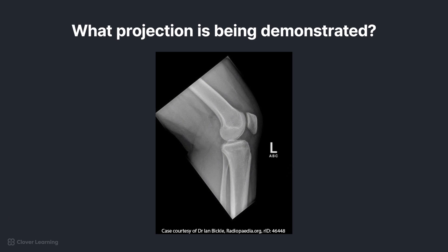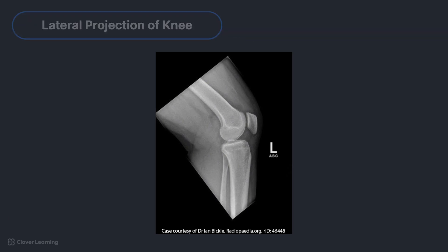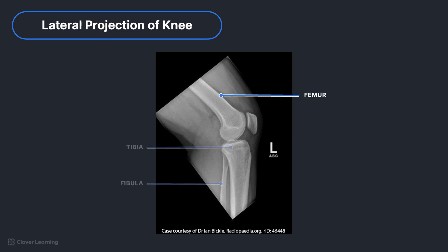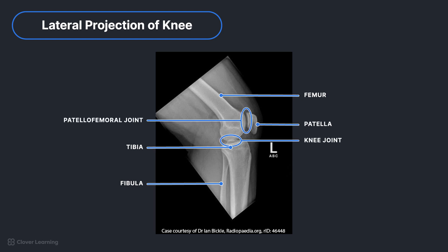We have one final projection for the knee. Yes, this is a lateral projection. We can tell it is lateral because the distal femur, proximal tibia and fibula, and patella are all demonstrated in lateral profile, and the patellofemoral and knee joints are open. We know this is a true lateral because the posterior borders of the femoral condyle are directly superimposed, and the fibular head is slightly superimposed by the proximal tibia.